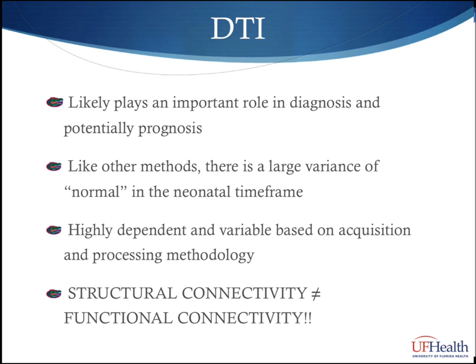So DTI likely plays an important role in diagnosis and potentially with prognosis. Like other methods, there's a large variance of what is truly normal in the neonatal time frame, and these findings fairly rapidly evolve over the first few weeks of life. As mentioned, the analysis is also highly dependent and variable based on both the acquisition and the post-processing methodologies. Even with close standardization, there can be quite a bit of variance from individual machine to machine.